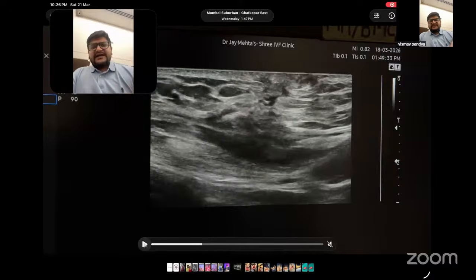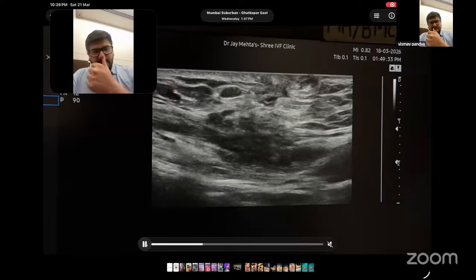And when that happens, the whole tissue layers are gone. And instead of just a very small surgical incision to excise this nodule, you have to perform a whole laparotomy, and you have to excise the whole incision and refashion it. Yeah, sir, you can start.